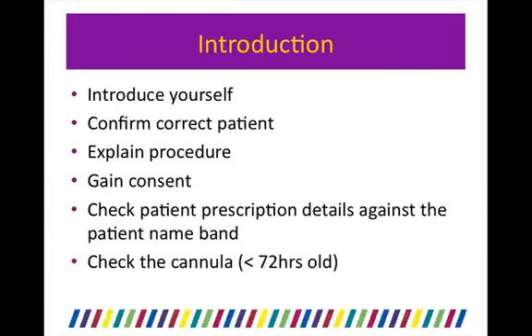Begin by introducing yourself with your full name and title and confirm you've got the correct patient by checking their name and date of birth. Explain the procedure to the patient and gain their consent. Check the patient prescription details against the patient's name band and check that they have a cannula in and this is less than 3 days old.